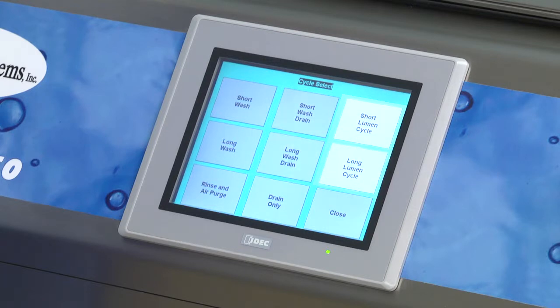Lumen cycles are for instruments that need to be flushed, such as laparoscopic, robotic, and orthopedic instruments. The short lumen cycle will wash for 8 minutes, drain, rinse, and air purge. The Long Lumen Wash will do the same but with a 13-minute wash.